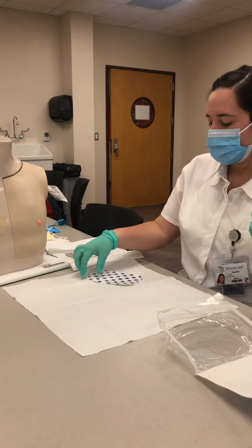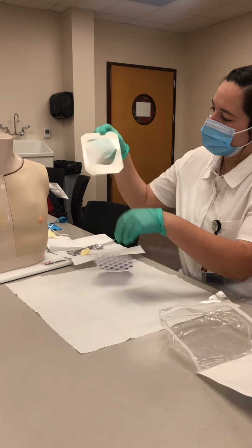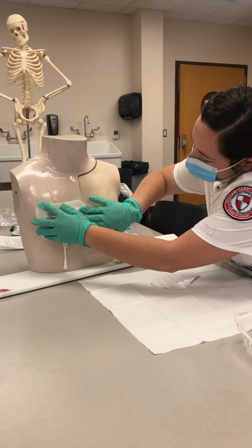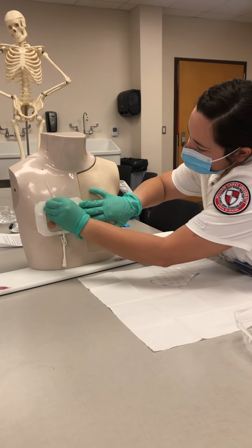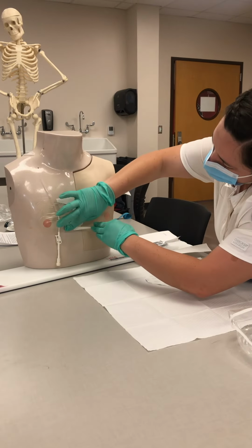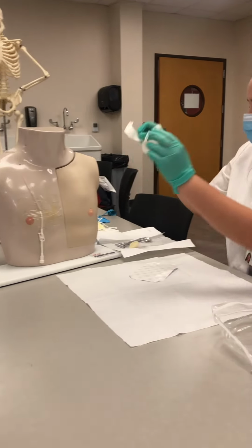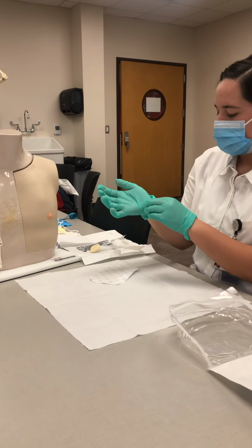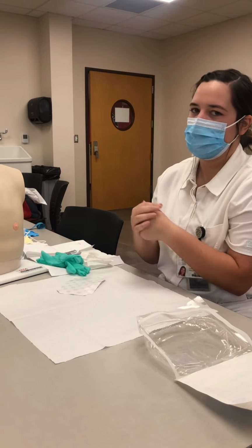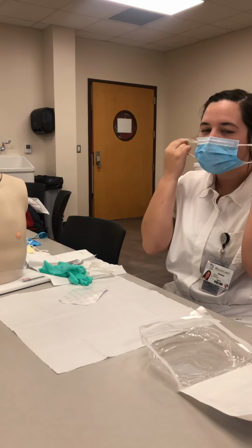Once that's air dried, we're going to take our tegaderm. And we're going to fasten it on top of the catheter like that, and making sure to take off the backing. And then throw that away. Okay, and now we can take off our gloves, wash our hands, and take off the mask.